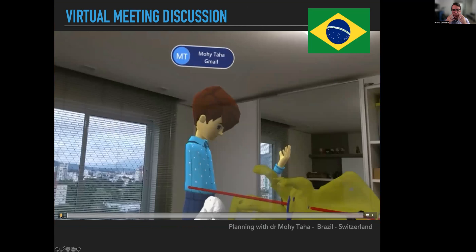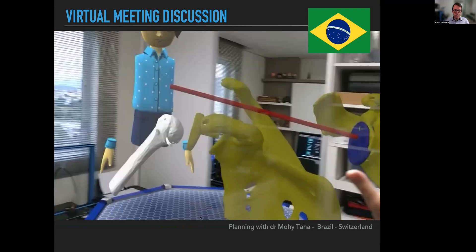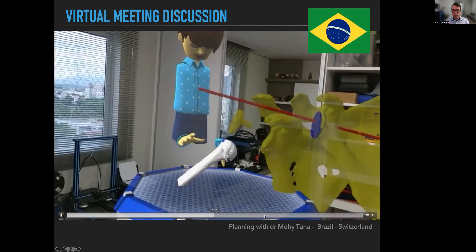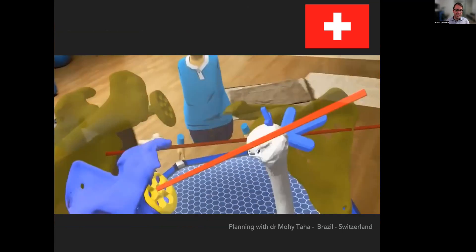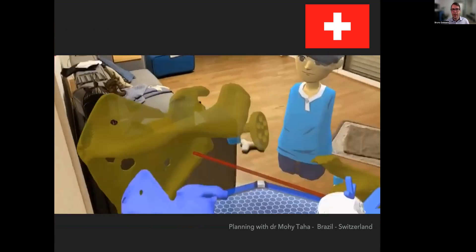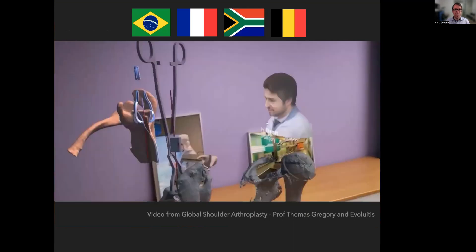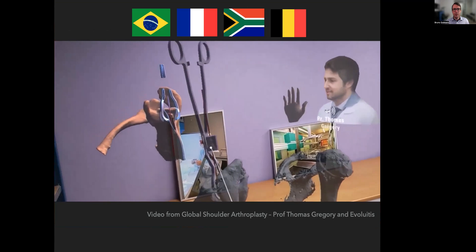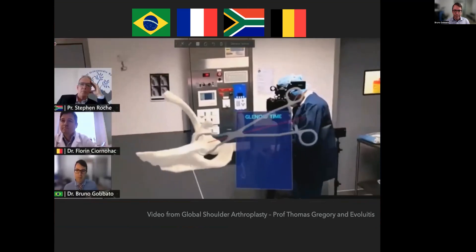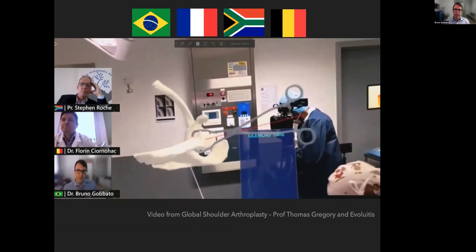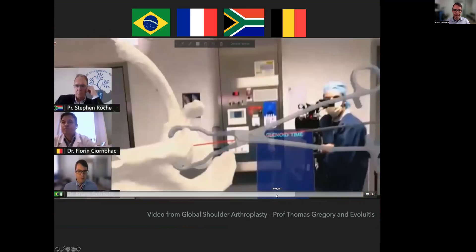Here is another example: this is my field of view — I'm using the glasses, this is my office — and Dr. Mohy Taha and I are planning together a reverse total shoulder arthroplasty, discussing what we are going to do. This is Dr. Mohy Taha's field of view from Switzerland — now he's seeing me — and this is the same planning done together, me in my home in Brazil and him in his home in Switzerland. We also did a meeting with surgeons from Brazil, South Africa, France, and Belgium — four surgeons discussing a case from Professor Thomas Gregory. And this is the surgery that we helped Professor Thomas Gregory perform: a reverse total shoulder with three surgeons live in the procedure.